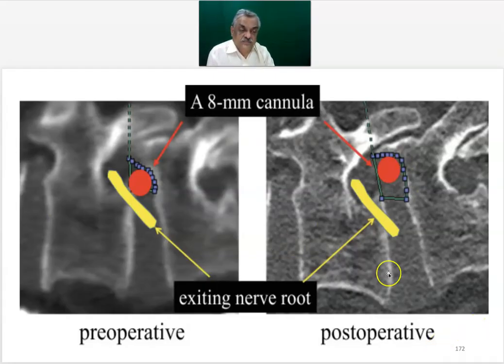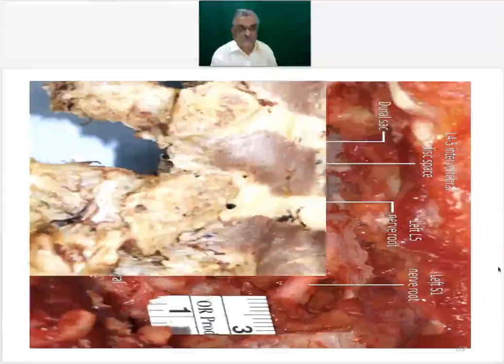In the upper zone anyway, we never go above the nerve, so our surgery is more related to the end plate here and the ligamentum flavum and hypertrophic tissue here. But in the lower zone, we need to improve the access by doing a foraminoplasty and go for the channelplasty.